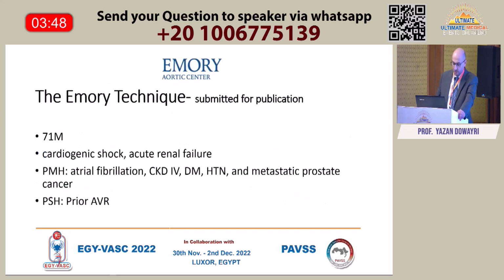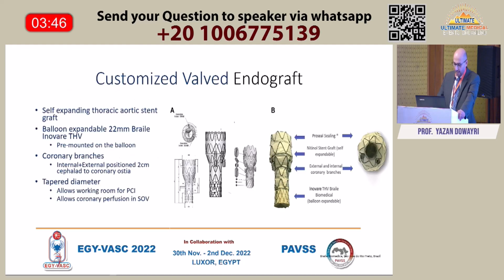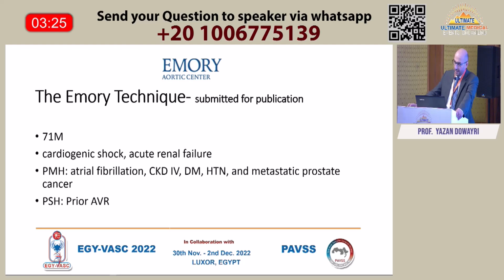So this was the device that was used, and they reported good success with good survival for that one patient. Now again, there's another paper that was in print, and I'm not quoting it here. It was a physician modified endograft with no coronary stenting, but just a stent graft with an aortic valve deployed in. Now, our case, as far as I know, is probably the third in the world.